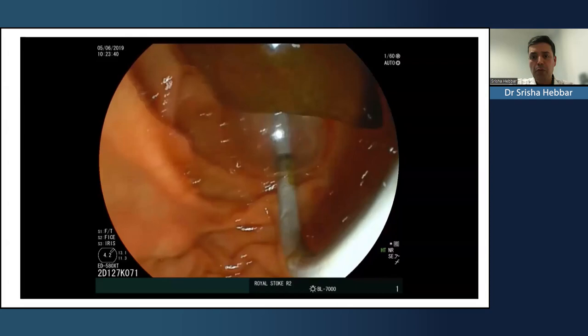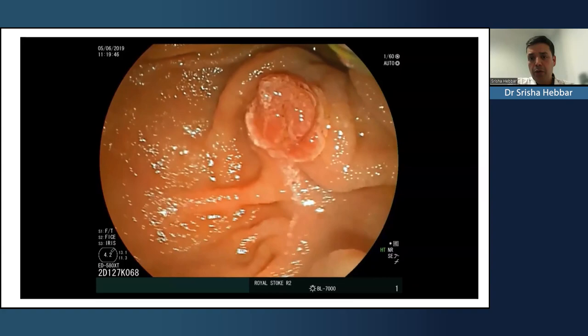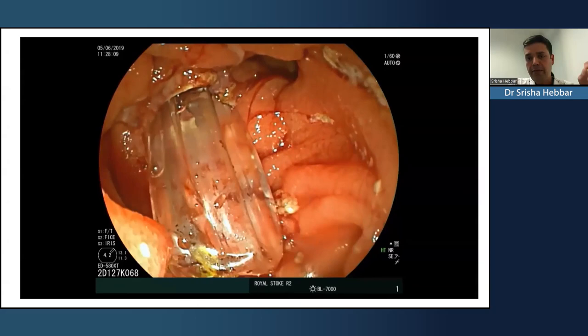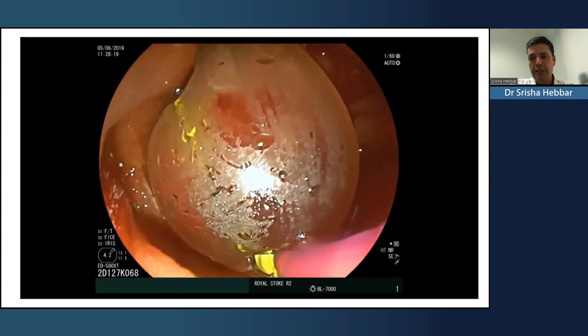Or in situations like you have where you have an ampulla in the periampullary situations, here you have to be really careful because the infundibulum is not very marked. You don't know exactly how much to cut, what's the limit of it. So in this situation, it's much safer to do a small sphincterotomy and a sphincteroplasty, even if you're dealing with the smaller stones. And this will be a much more effective technique to remove stones when there is an ampulla in the periampullary diverticular setting.